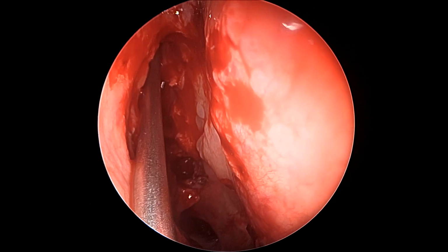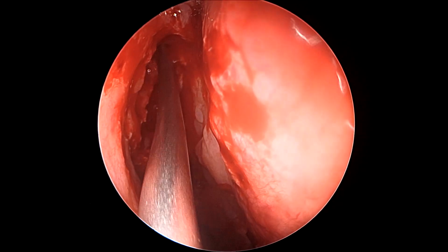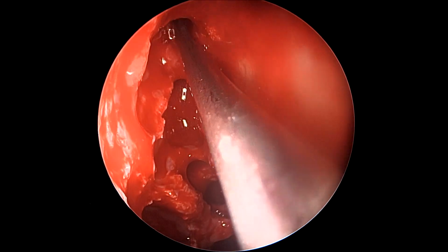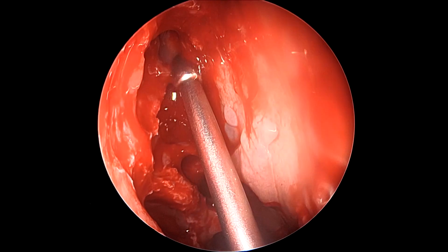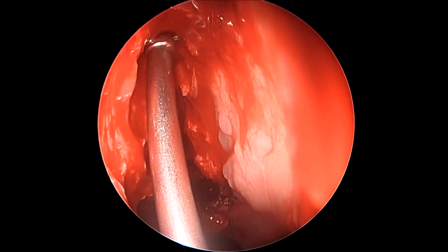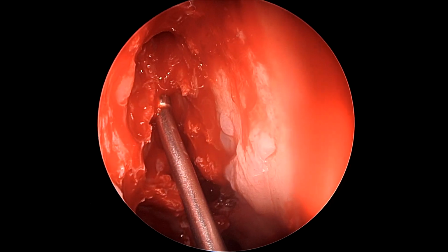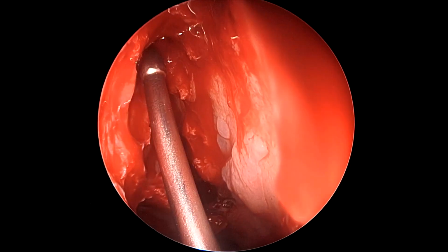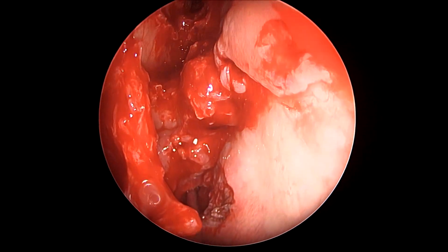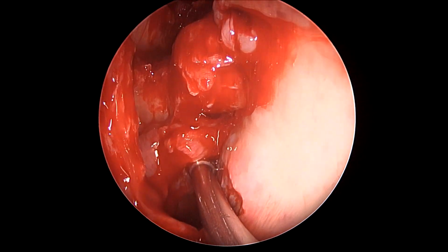Though our straight frontal sinus suction can go inside the frontal recess and the frontal sinus quite freely, this might just need a little bit more enlargement to prevent any post-operative stenosis. And we see here that we are constantly fracturing the posterior wall of the frontal recess, which are the type 2-3 cells, the Kuhn cells, to increase our access in the frontal sinus.